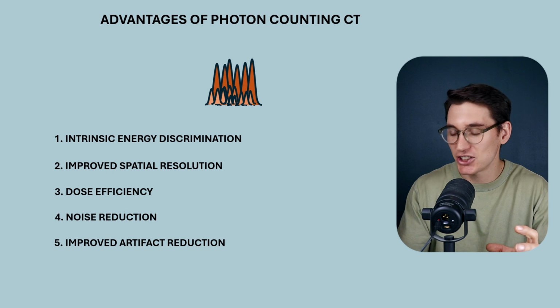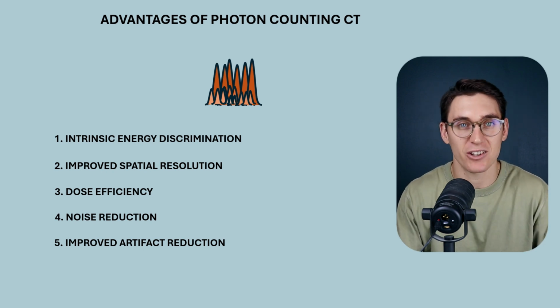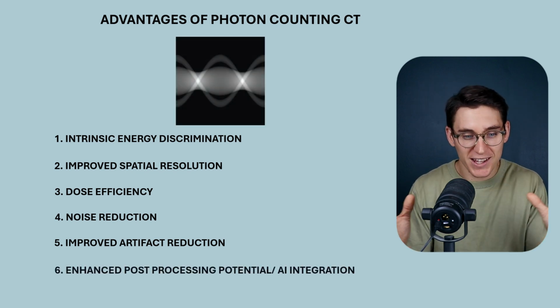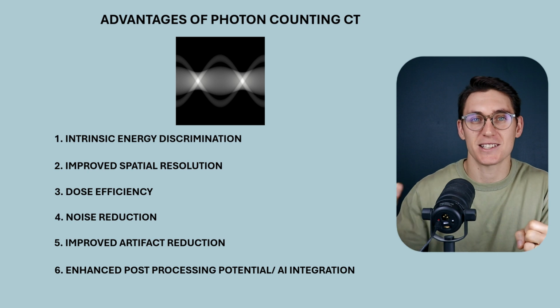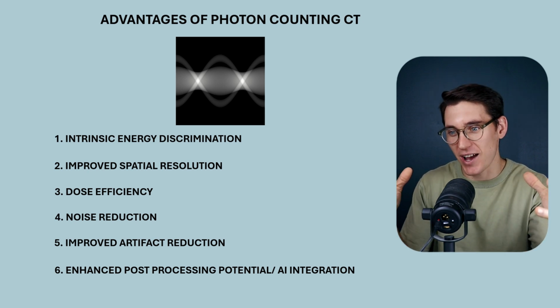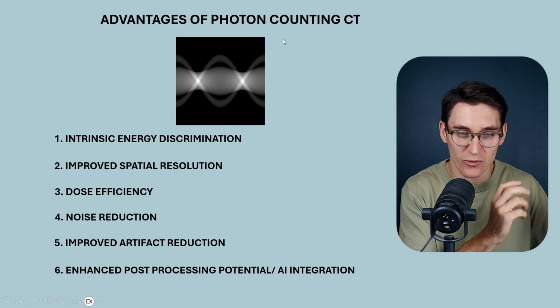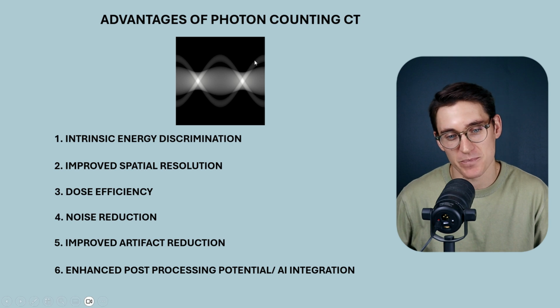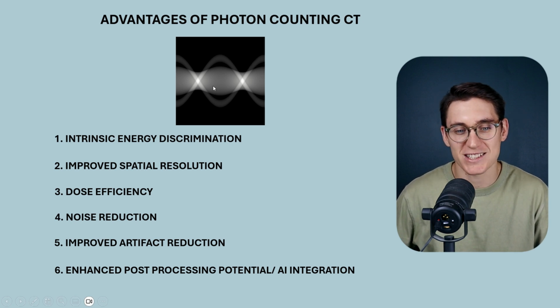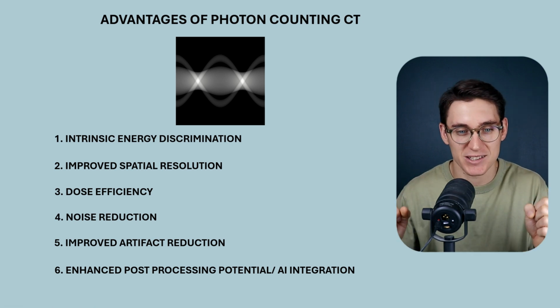And because of the sheer volume of data that we're getting, we have potential to address many other artifacts. And that brings me to the final advantage in this talk, which is enhanced post-processing potential, or AI integration. Big data that we now have the ability to manipulate more than the data that we had originally received in conventional computed tomography detectors. We saw in conventional CT detectors, we filled a sinogram and it was this data that we used to generate the image of one slice.